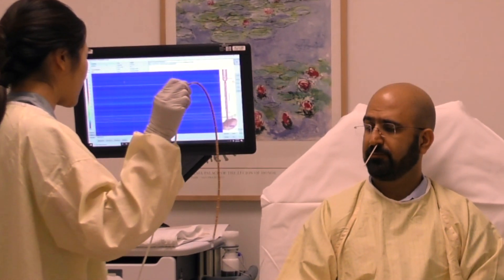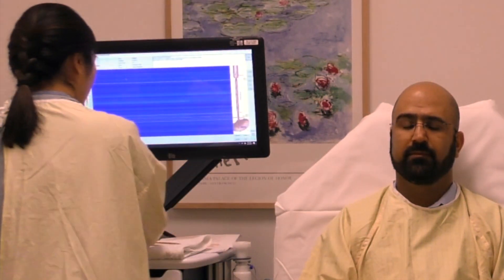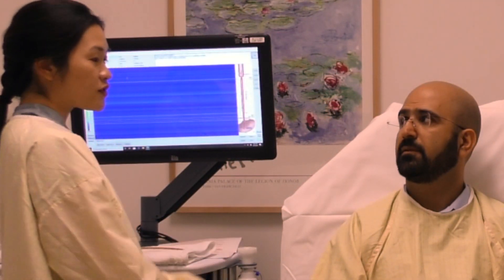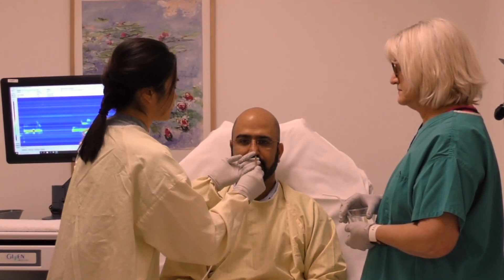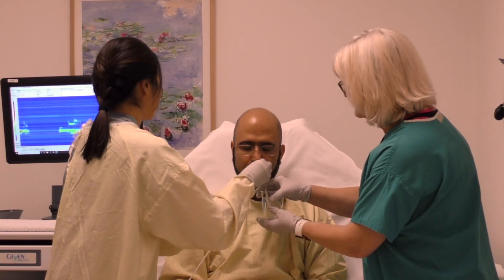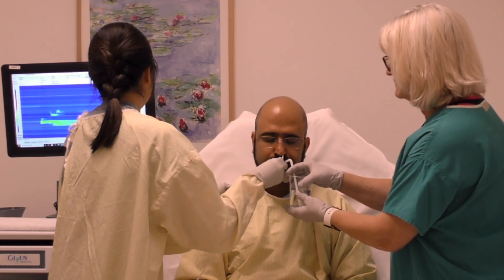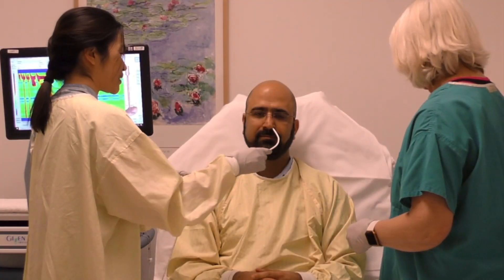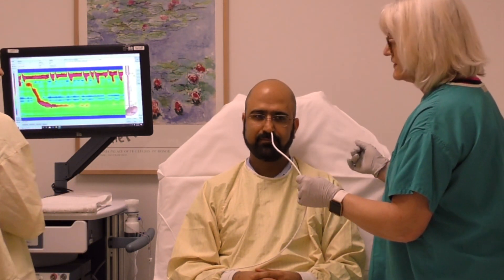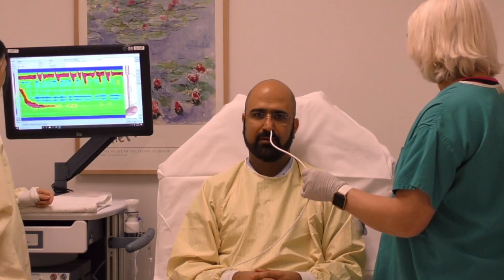I'm going to take the swab out of your nostril and put the catheter in. I will ask you to drink water when the catheter is in the back of your throat. You don't need to take big sips, just enough to get the catheter down. Keep a normal, neutral position for now. Now tilt your chin down, take some small sips of water, and swallow. Good job, the catheter is in. You can lift your chin to a normal position now. We're at 55 centimeters. Now for 30 seconds, please do not talk or swallow — you can keep your mouth open, it might help you not swallow.